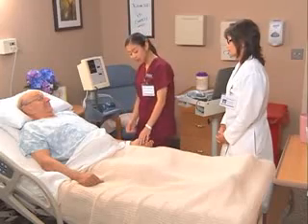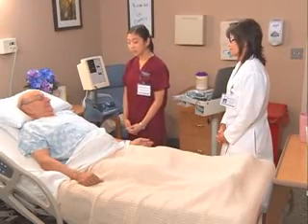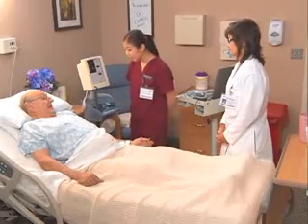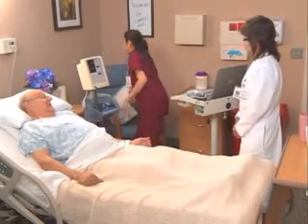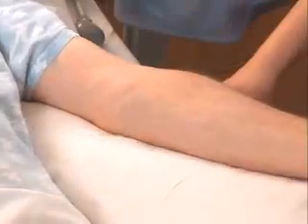High tech, huh? Any injuries lately on this arm? Medical procedures on this side, anything? Nope. Okay, let's use this arm. Now try to get comfortable. You don't have to bring in my recliner. Well, do the best you can. Arm like this, okay? I'm gonna roll up your sleeve and I'll put on the cuff.